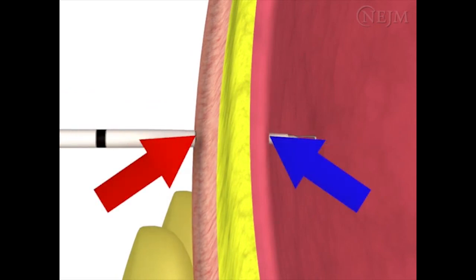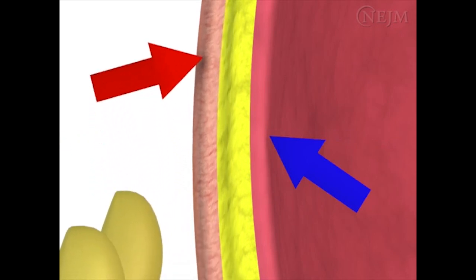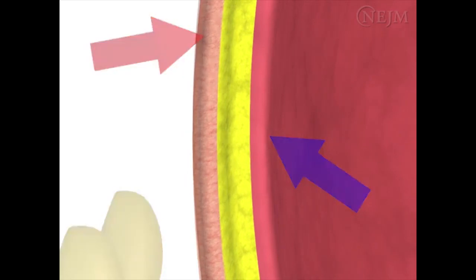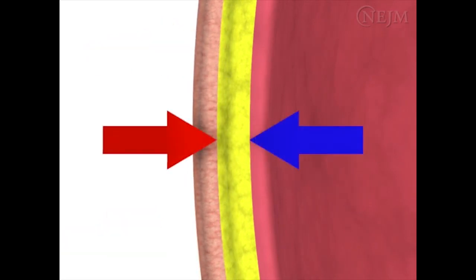When the catheter is withdrawn at the end of the procedure, the cutaneous entry site will retract to its original position. Both techniques ensure that the cutaneous and peritoneal insertion sites do not directly overlie each other, theoretically minimizing the risk of an ascitic fluid leak following the procedure.